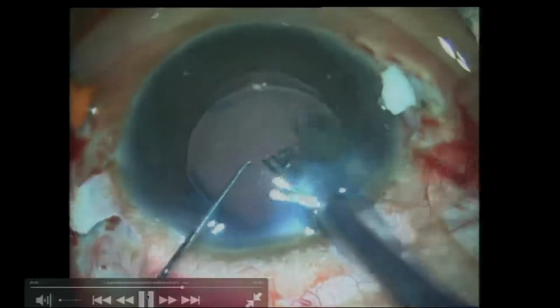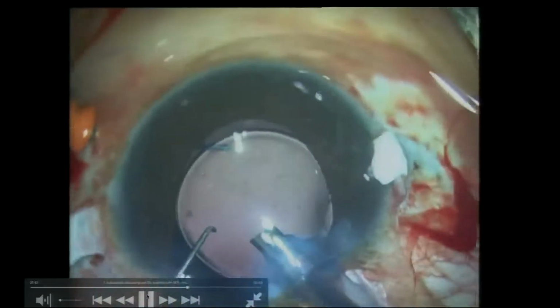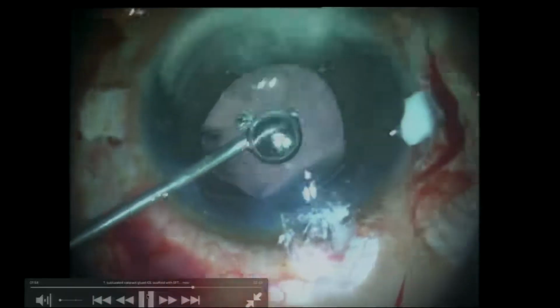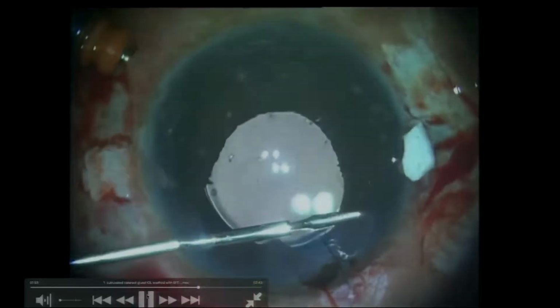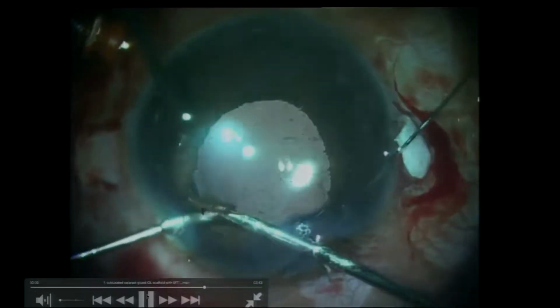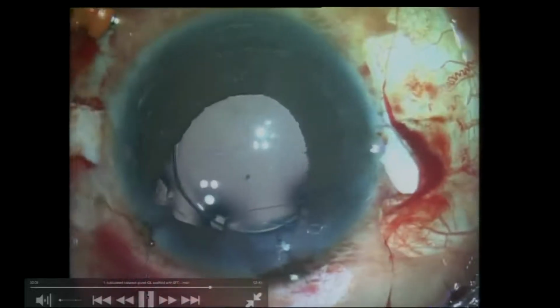Now once the whole lens is removed, I also have noticed that the superior iris is kind of flaccid and not really intact. So first doing some triamcinolone to check if there's any vitreous. Fortunately, in most of these cases, I've never found vitreous come forward unless you have gone and disturbed the vitreous in a traumatic way. I didn't cause any trauma.